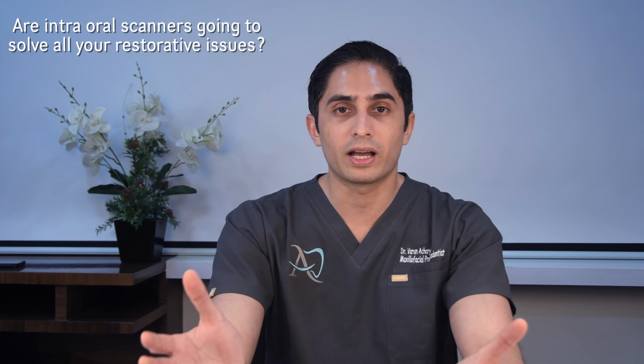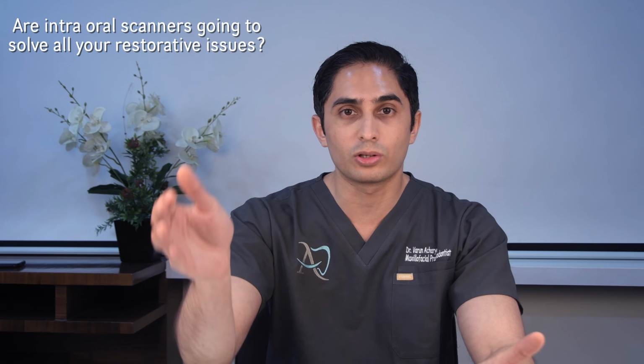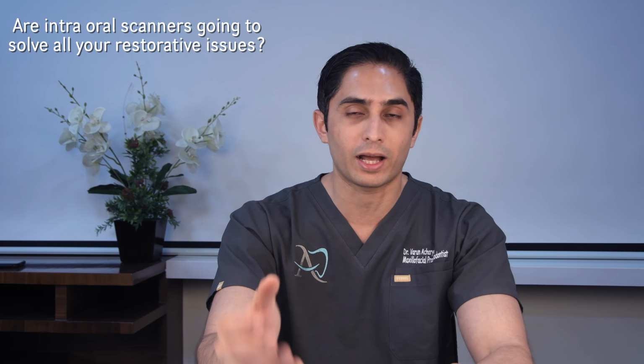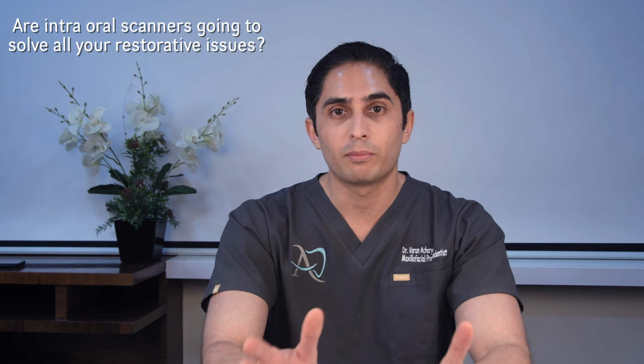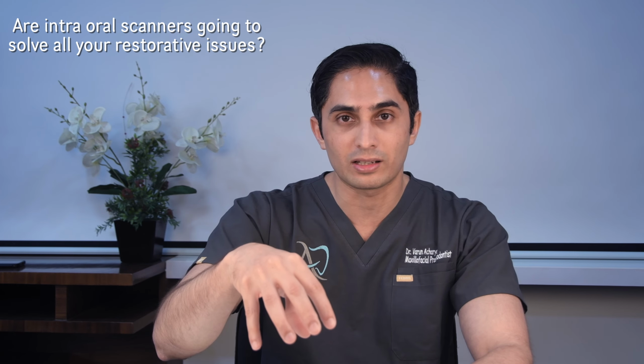Sometimes you may have tissues or your margins which are a little bit below tissue, where there's a hood of tissue covering that margin. Your light body material is going to flow in and capture that margin, but your scanner will not be able to capture that margin because there's tissue covering it and the scanner is not able to see it directly.